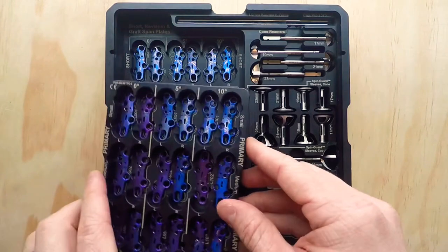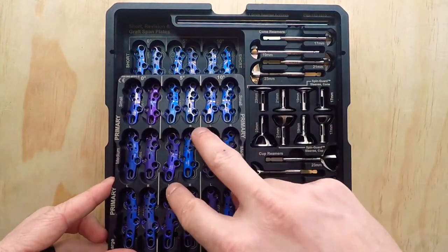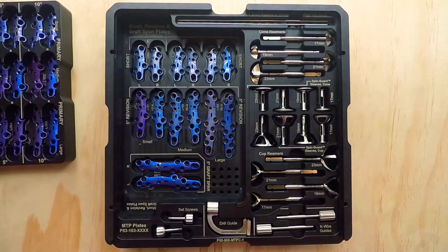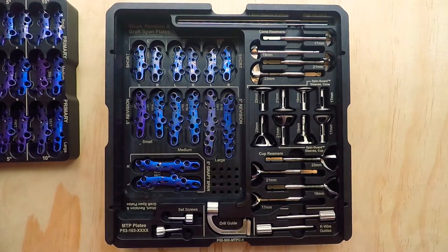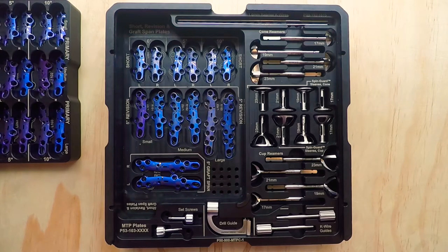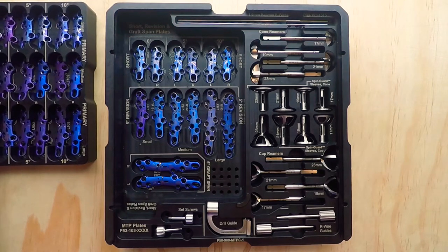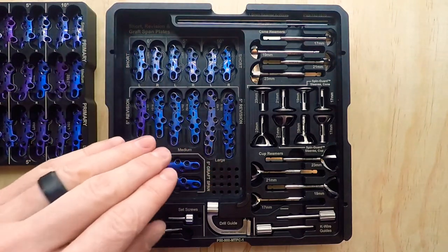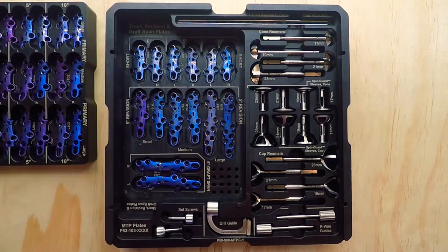These primary plates are 1.3 millimeters thick — a very low profile plate. When you put the screws in these plates, they do not get thicker. That's very important, because I've worked with companies in the past where plates are marketed as low profile, but the second you put a non-locking screw in, they go from 1.3 millimeters to 1.8 millimeters because of head prominence. All of our screws sit inside the plate — zero head prominence.